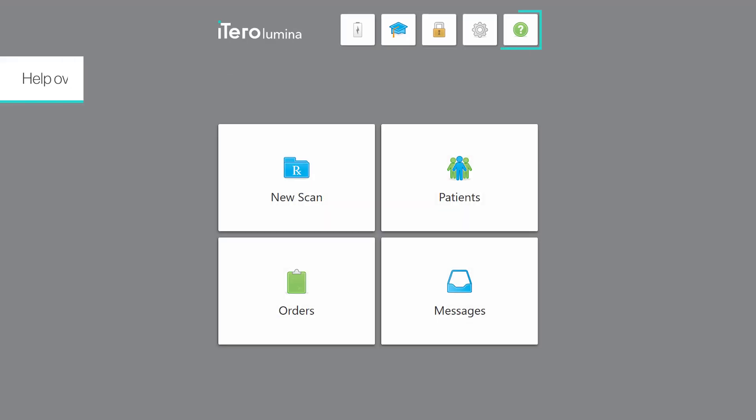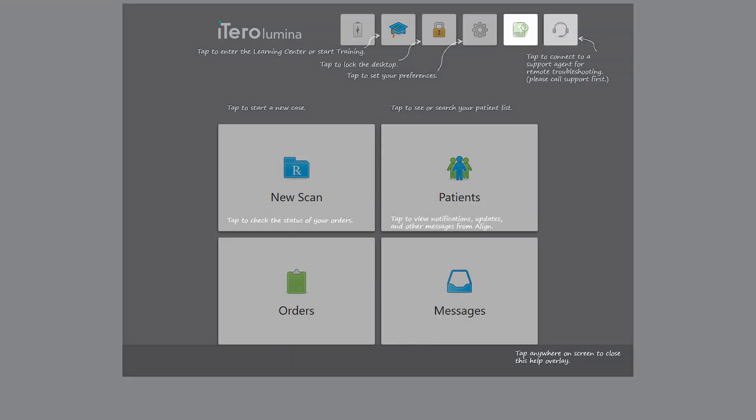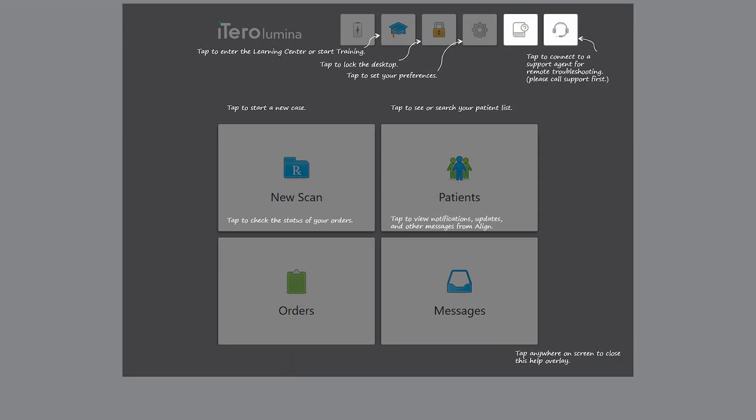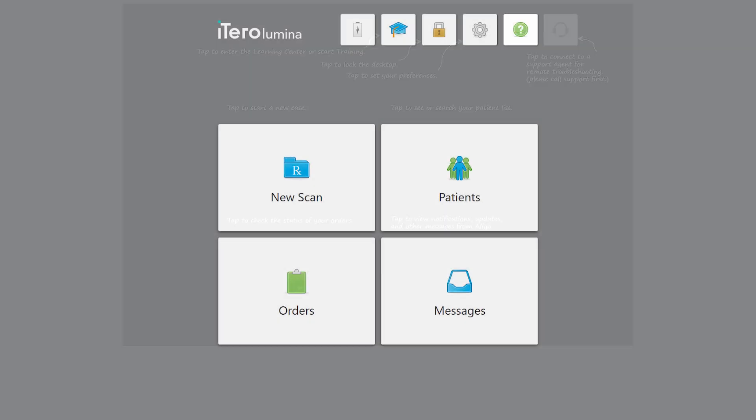Finally, tap the help icon to display an overlay with the descriptions of the screen icons. In the help screen you can also access the electronic user manual, and display the remote connection details when receiving remote assistance from the iTero customer support. You can tap anywhere to close the help overlay.